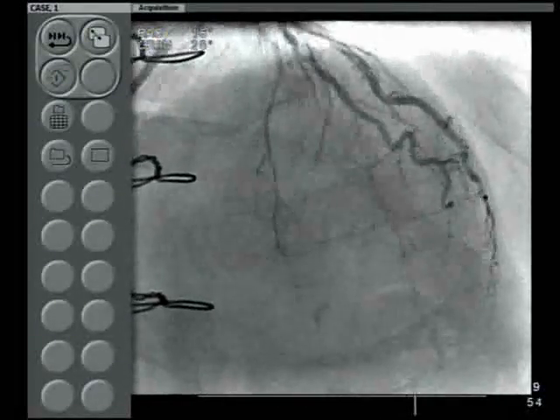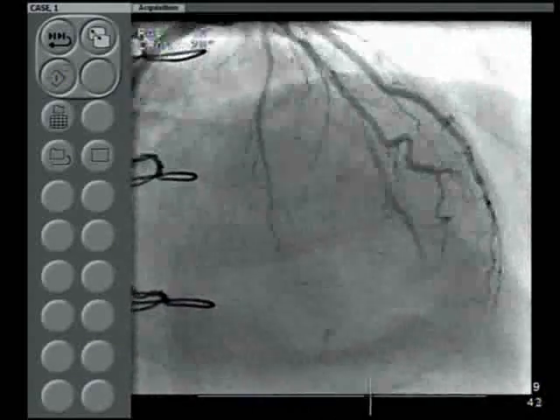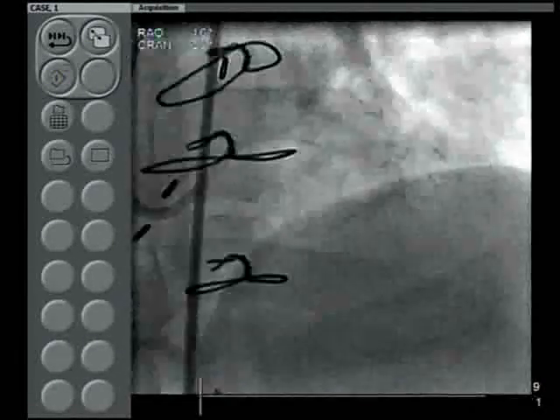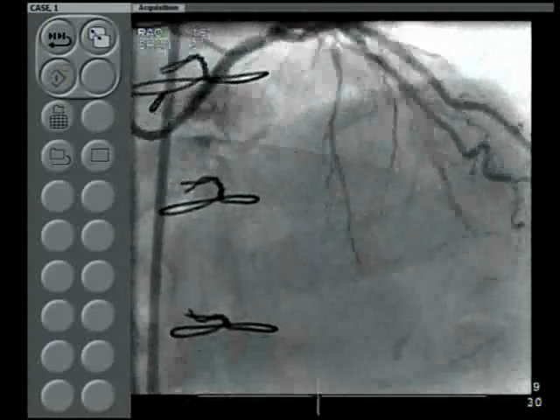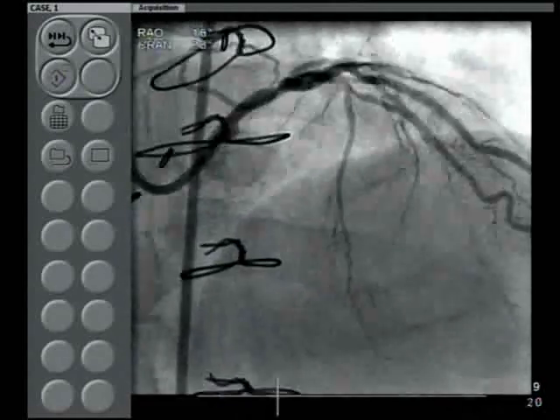Now, our goal in this particular case was to analyze where exactly the disease is, because the theme today is how do we use IVUS in our day-to-day life in terms of improving the overall outcome of the drug-eluting stent strategy. Now, IVUS has been done.